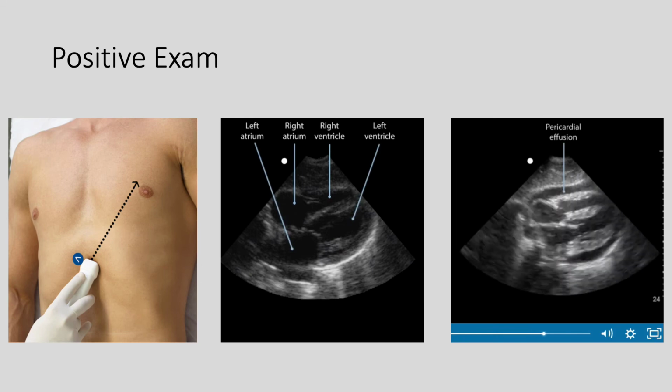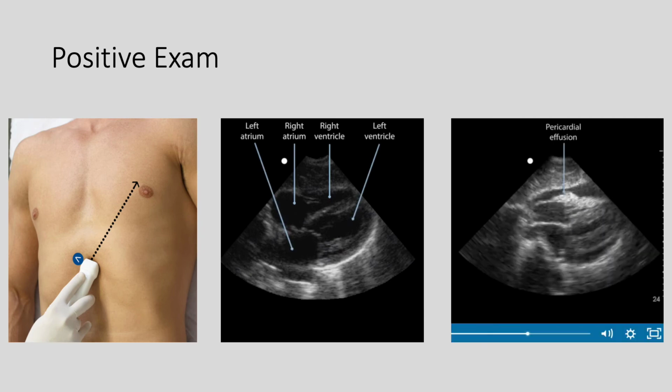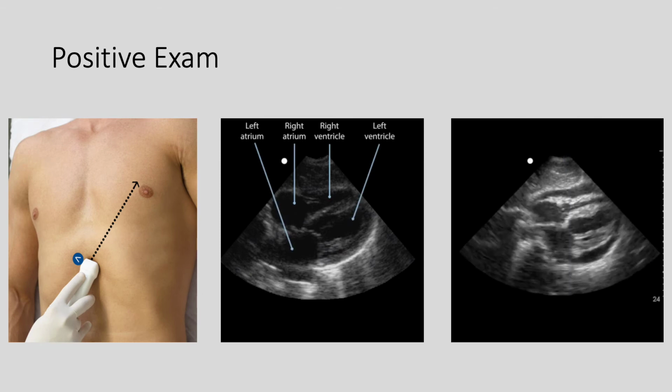The liver is a key acoustic window, and it is helpful to find the liver first by angling the ultrasound beam towards the right upper quadrant and then following the liver to the patient's anatomic left and finding the heart.